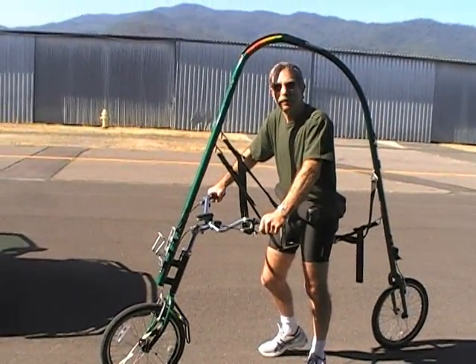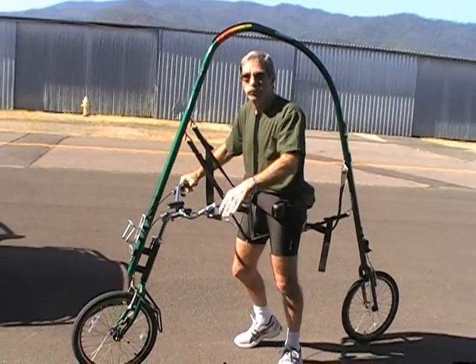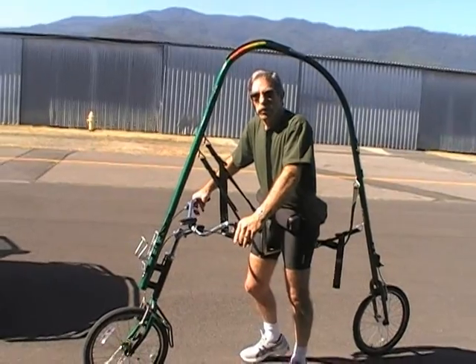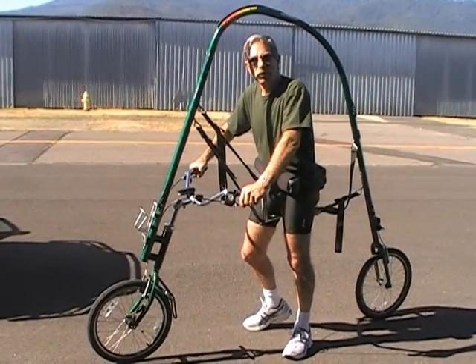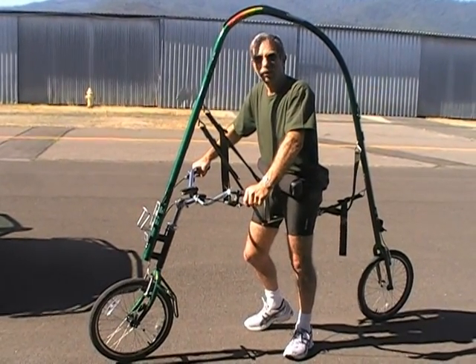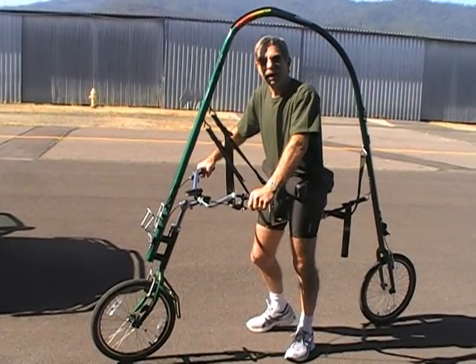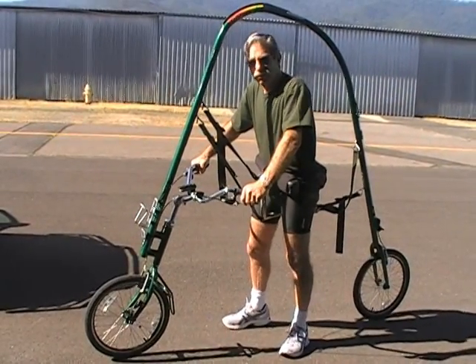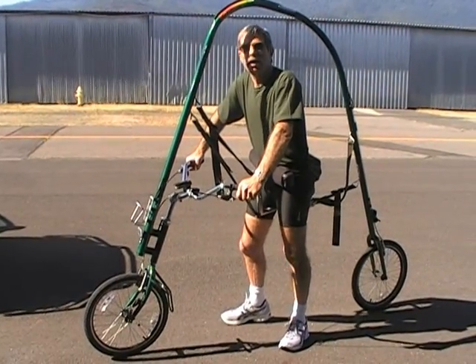Now, what were the traditional techniques used for rehabilitating those kinds of injuries before body unweighted technologies such as the GlideCycle, GlideTrack, and AlterG came out? Well, the standard physical therapist has parallel bars and a walker, but people who don't have good upper body strength have a lot of trouble on the walker and have a lot of trouble on the parallel bars. So they're sort of very limited on getting up and walking because they can't put full weight on their legs, but they don't have their own upper body strength to keep the weight off.